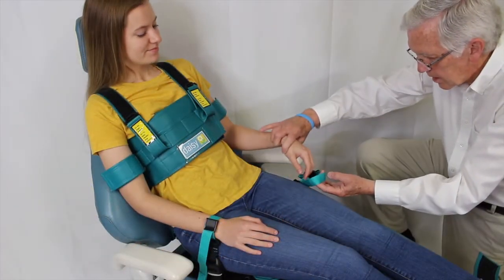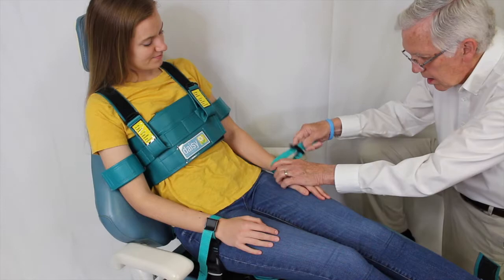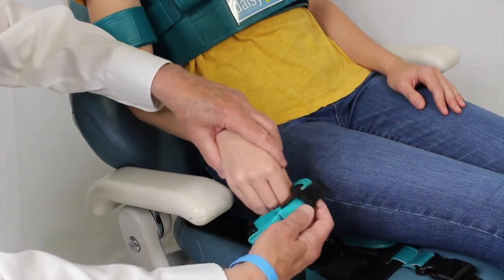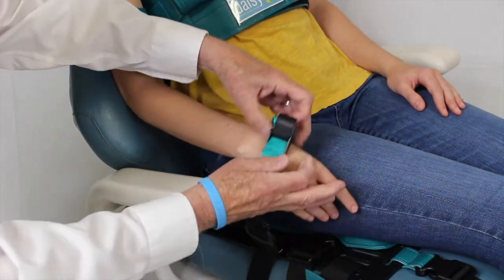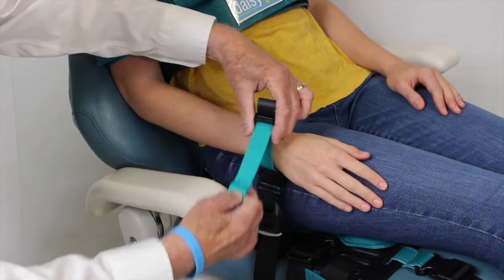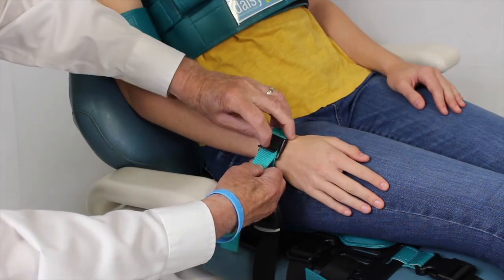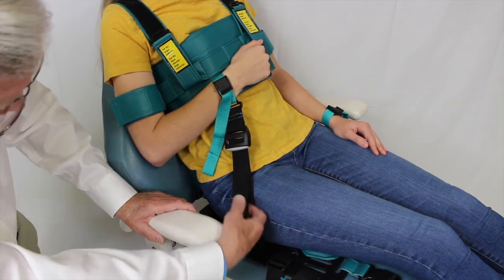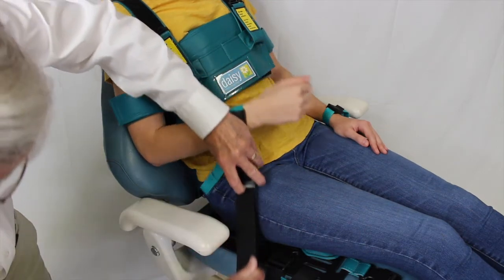Wrist straps. The wrist straps are designed to prevent patients' hands from reaching their mouth. Position the patient's wrists in the wrist strap loop. Pull wrist straps snug on patient's wrists. Lock cam buckles in place. Wrist straps should be adjusted to the lowest position, providing comfort and preventing patients' hands from reaching their mouth or releasing any of the securement features.